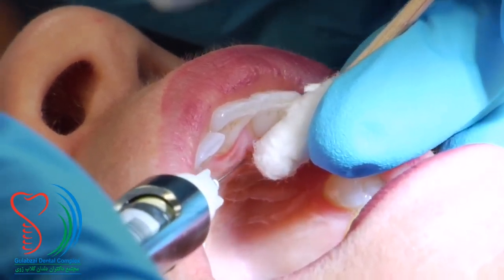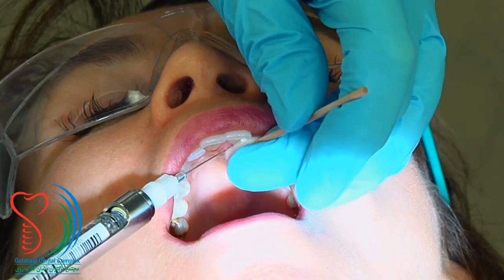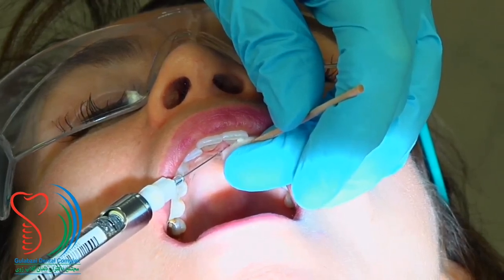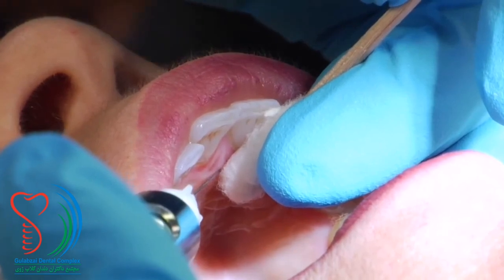Then slowly letting the needle slide into the tissue until you've met resistance at a depth of about 1/4 of an inch. After negative aspiration, very slowly deposit 1/4 of a carpule or less with aspirations.